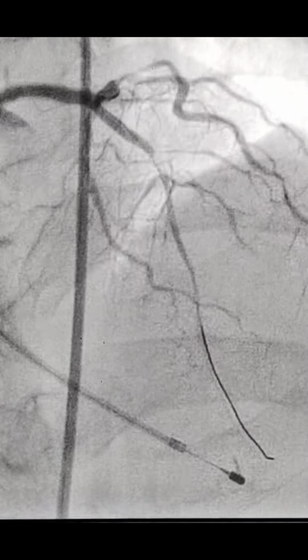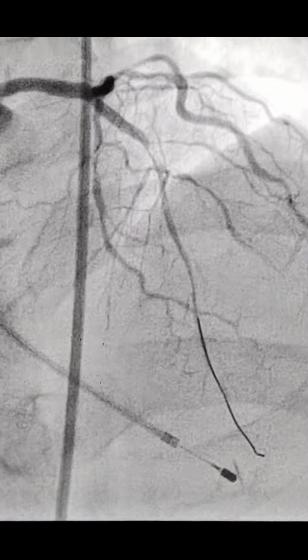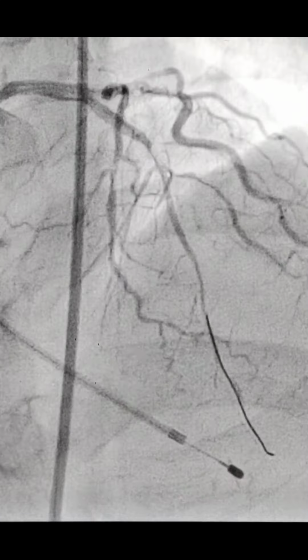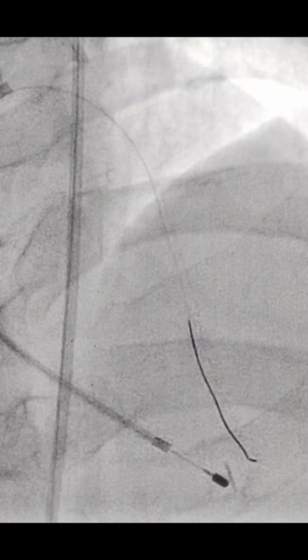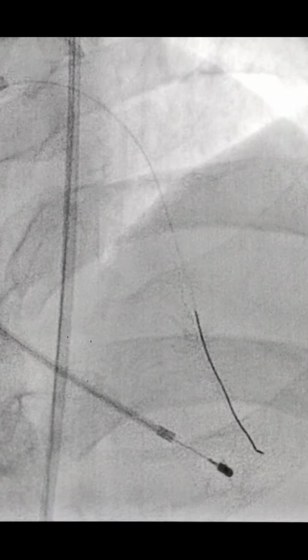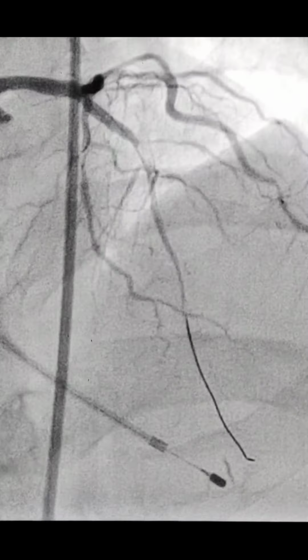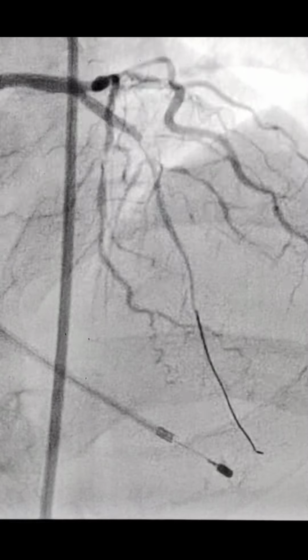This thrombus was organized, and after 5 to 10 minutes this wire crossed in the LAD, and you can see the LAD. The distal LAD was very thin and diseased, because this patient had uncontrolled diabetes. On presentation he had a sugar of 500, GRBS of 500. He was a drug defaulter for the diabetes, and this is the picture.